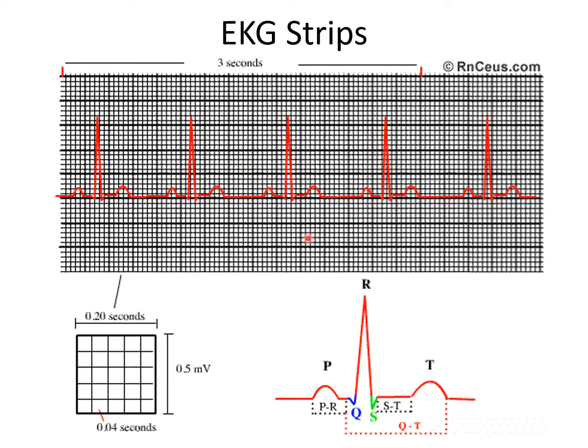Okay, I'm not asking you to look at the vertical axis, but I want you just to understand that if you get into advanced EKG interpretation, you will look at those things as well. But in other words, there's a little bit of leeway. It doesn't have to be exactly straight. It can have a little bit of a depression, and that is not significant. But you don't want the elevation or depression to be more than 1 millimeter. Okay, so there's a little bit of wiggle room there, a little bit of depression or elevation, but not much.